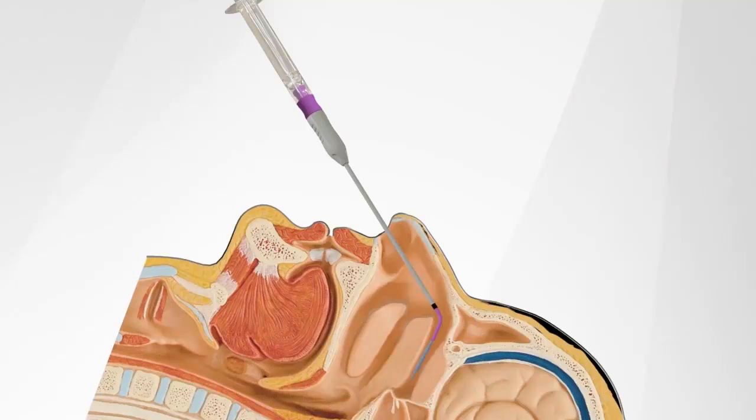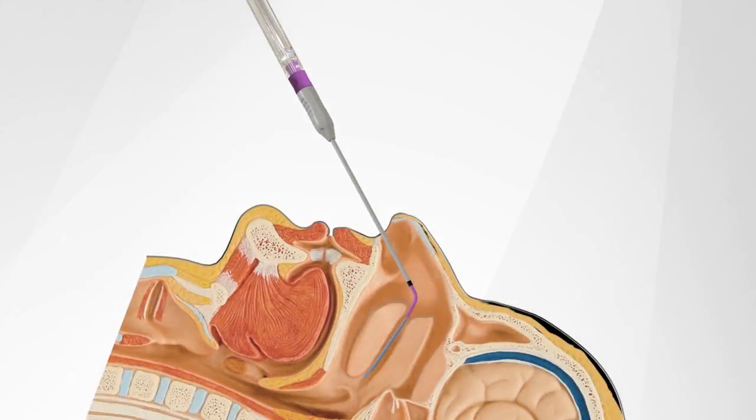If the head is appropriately tilted back and the catheter is correctly positioned, little or no lidocaine should run down the throat until after the procedure and the patient sits up. If the patient feels a significant amount of lidocaine run down the throat, the catheter has likely been placed in front of or below the middle turbinate, which is too low. In this case, make sure the patient's head is tilted far enough back.